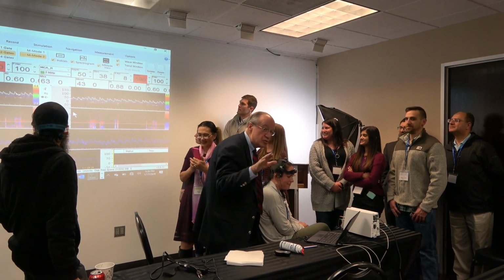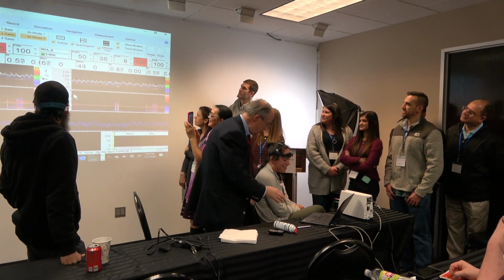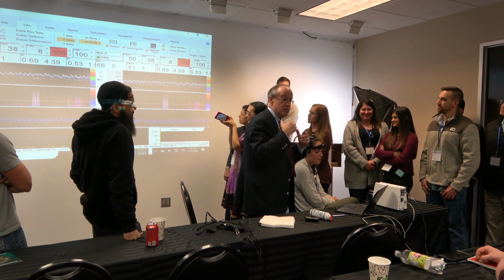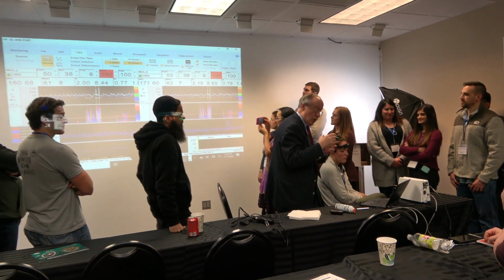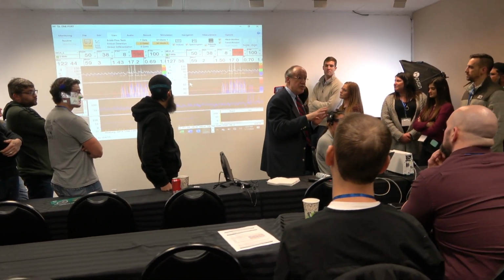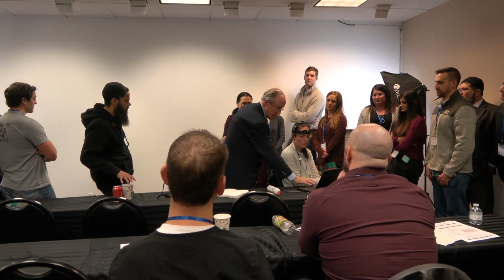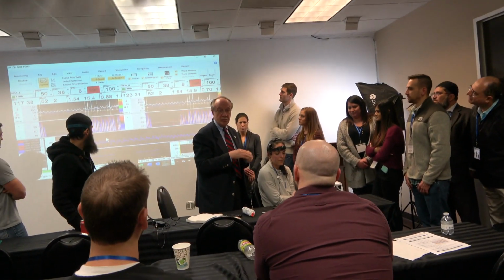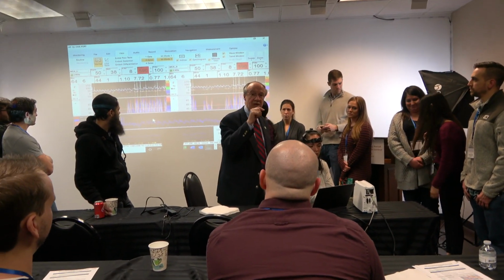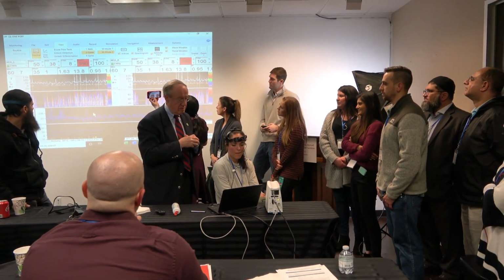So flow goes down, as you can see. This is normal. So flow goes down, all right, and you can control whether the patient did Valsalva well. So why does flow go down? Because increase in intrathoracic pressure decreases venous outflow and increases intracranial pressure, and we are seeing very specific changes. So flow goes down, PI increases, etc. All right. Questions for me?